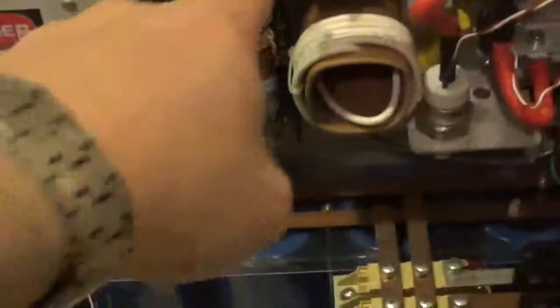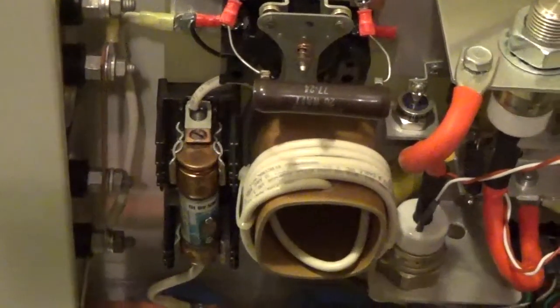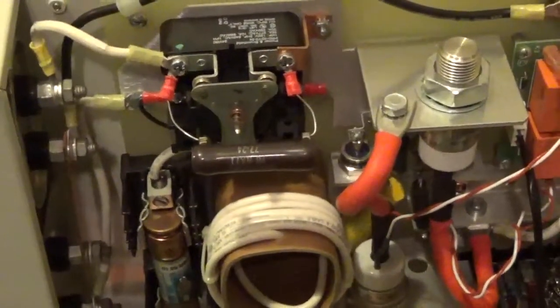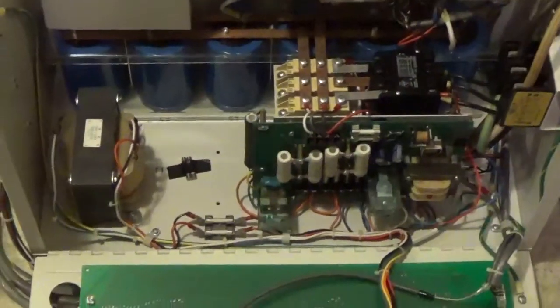This is an important relay right here as you're switching through high, medium, and low power, because this is an isowatt generator, it doesn't have MA stations. That's full and half power right there. And that's the DC rail. That 60 amp fuse will blow. That's normal, sometimes it pops. Once in a great while, it'll happen. So let's get everything hooked up, and then we'll go to the scope and come back here.